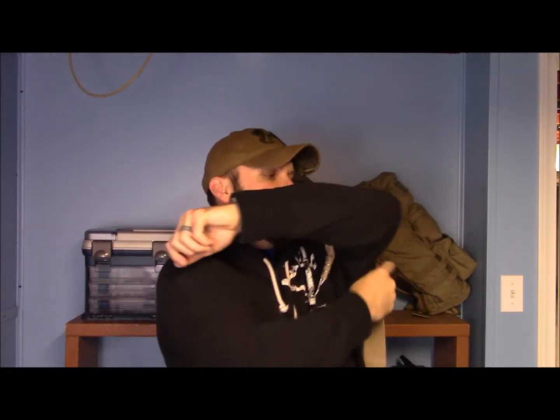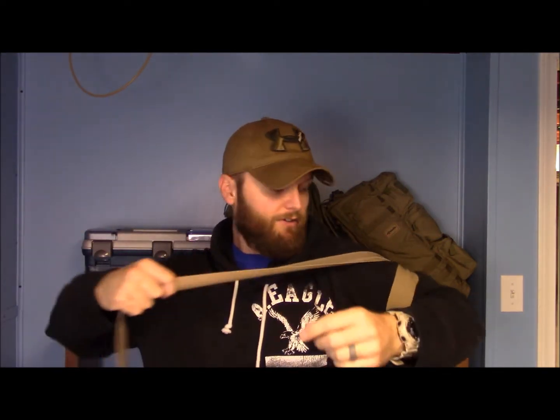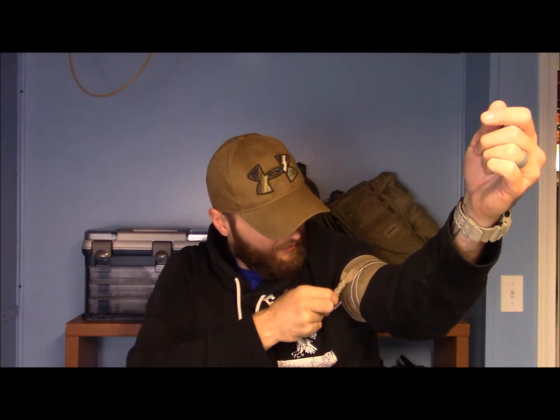One of the most popular elastic style ones is the RATS tourniquet, and I don't have one of those, but I do have the TK4 here, which has these two hooks on either end, and it is elastic. The way you're supposed to use this, say you get shot in the arm, for a one-handed application: you hook this back through that hook, pull it across your body, wrap it around again, pull it across your body, wrap it around again, and then use this other hook to hook inside the tourniquet itself, and that will hold it in place.